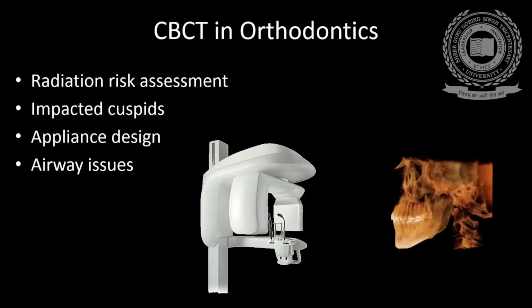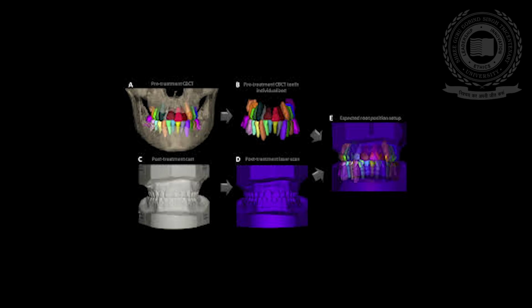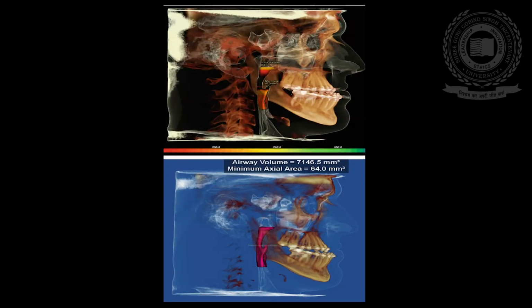In orthodontics, CBCT is useful in cleft palate assessment, tooth position and localization, resorption related to impacted teeth, measuring bone dimensions for mini implant placement, evaluation in rapid maxillary expansion, three-dimensional cephalometry, surface imaging integration with superimposing of face scans, airway assessments, and age assessment for planning orthognathic and facial orthomorphic surgeries.